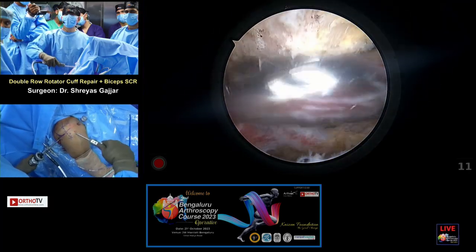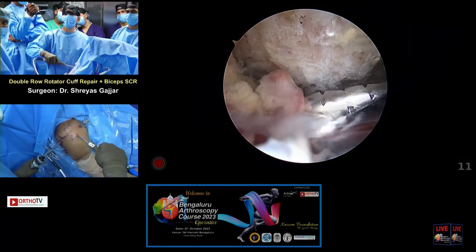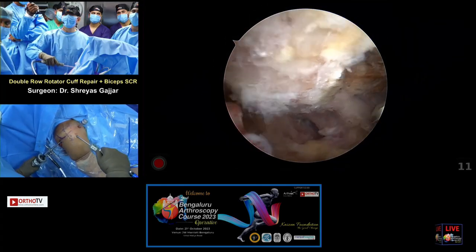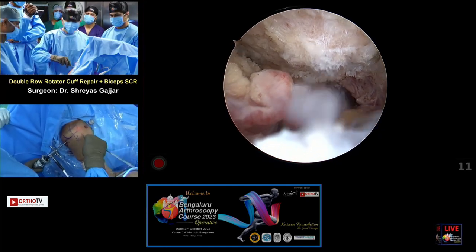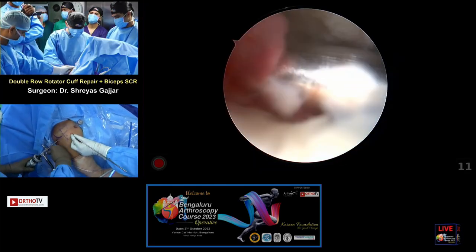No, coracoid impingement is generally for large tears, not for this superficial tear near the lesser tuberosity. Okay, so once I do that, Switching stick, please, I tend to change the viewing portal. So from posterior viewing, I'm now going to go to anterolateral viewing portal.